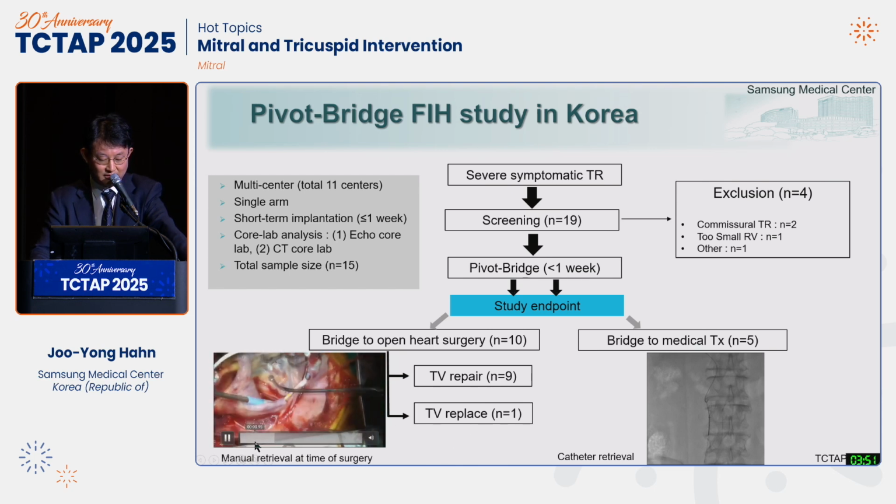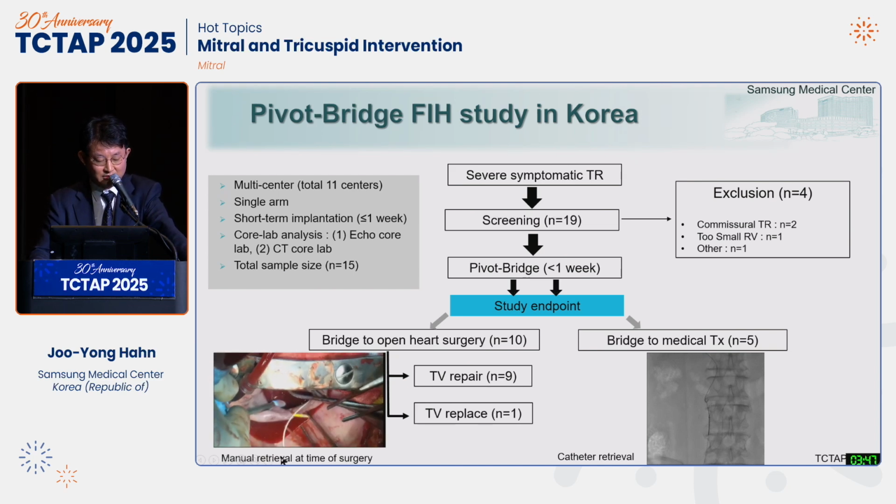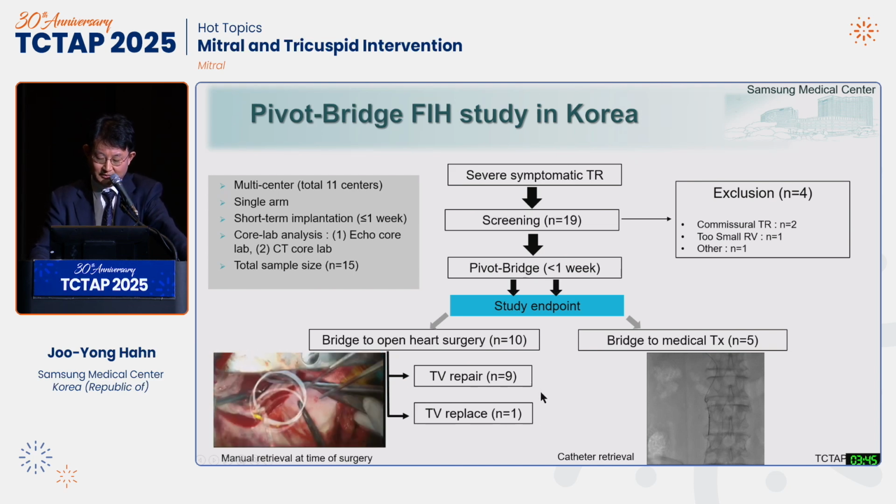The Pivot Bridge was manually retrieved at the time of surgery, and 5 patients were stabilized by medical treatment. In these patients, the Pivot Bridge was retrieved percutaneously.